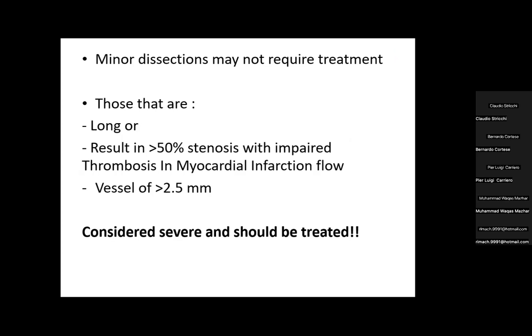Yeah, that's quite clear. In my practice, the most common catheter causing a dissection in the left main is, for a diagnostic catheter, a Judkins left. And for the guiding catheter, as you said, the Amplatz. But overall, for the right, AL1 is the most supportive guiding catheter.